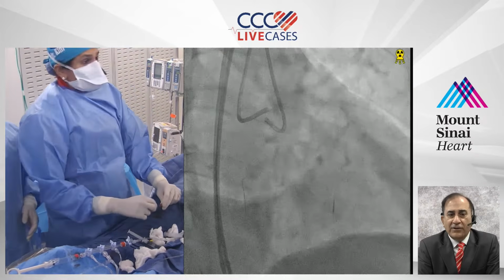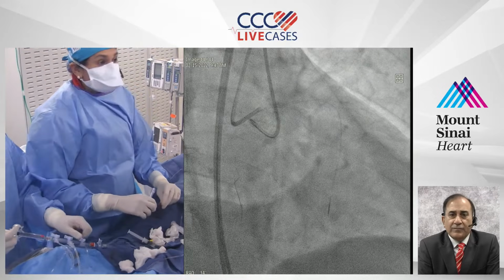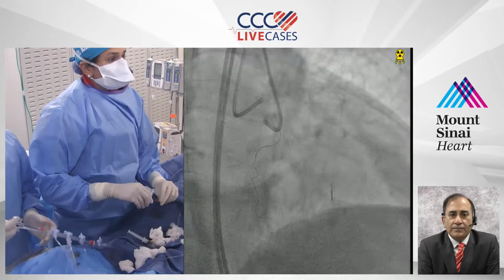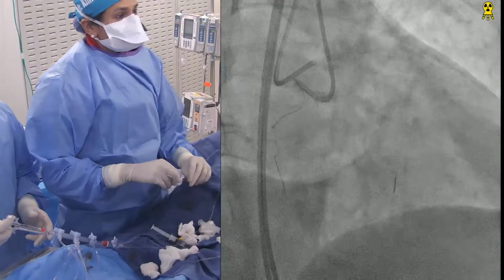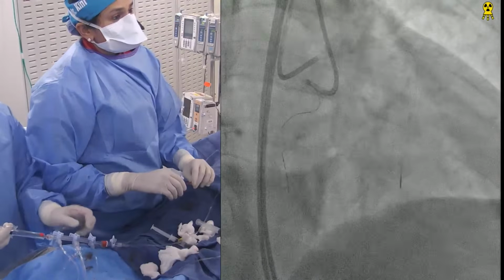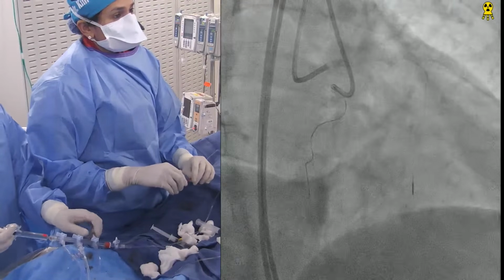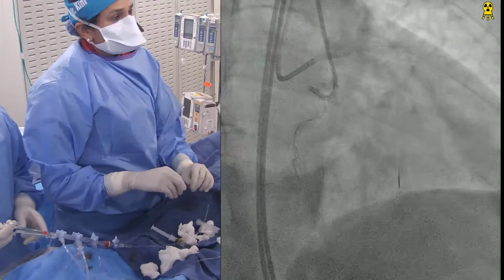I never reached that conclusion. What are you using now? I tried initially, now this is Progress 200. So if you see here, I need to make a connection. I'm seeing if I can get a little dye. It looks like it's just going into the subintimal area. A little subintimal that goes into the main lumen is fine.